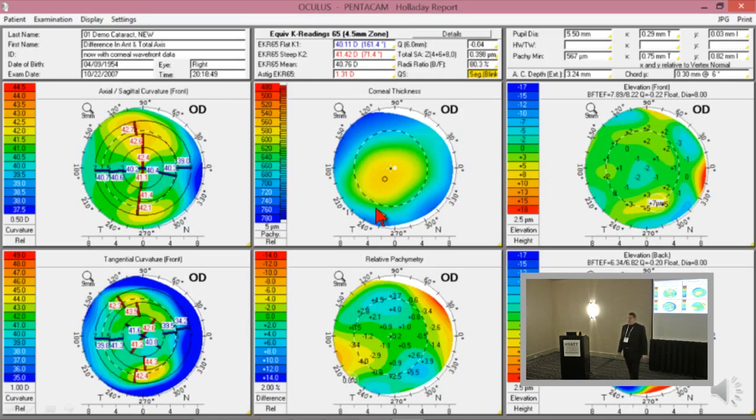And by the way, the higher the amount of astigmatism, the more important those broken lines are. If you've got 1 diopter of astigmatism and the lines are broken, it's not that bad. But if you've got 2.5, then there's no way you're going to be able to line up that high-powered toric lens. You see all these breakups over here. It's a little bit of an asymmetric bow tie. We see the circle is down, and we find out that the thinnest point now is almost 0.75. That's a little bit unusual.